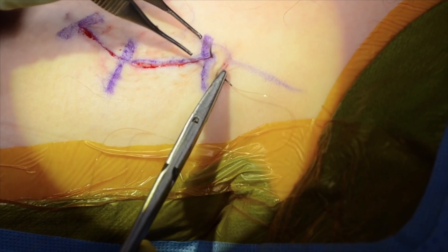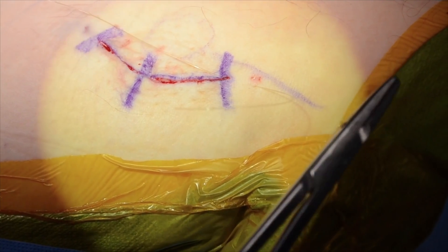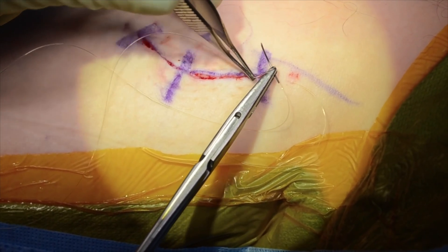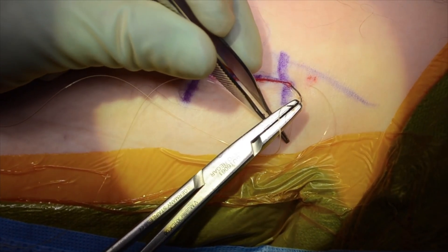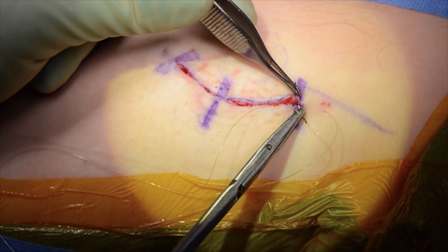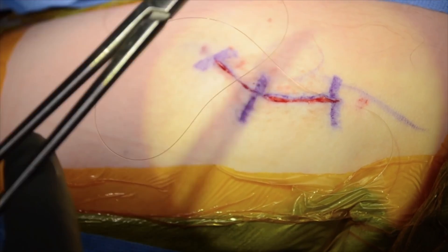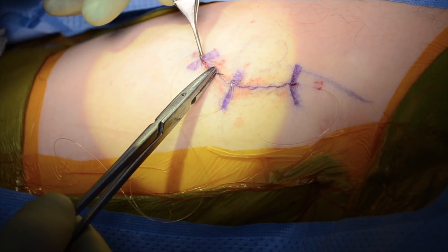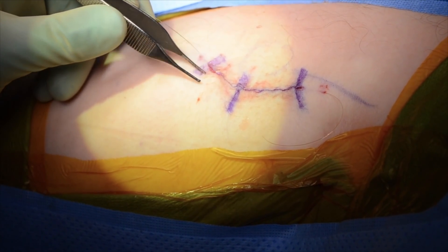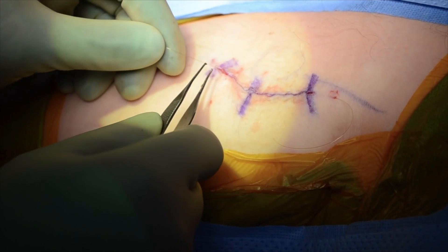The skin is then closed with a subcuticular 3-O monocryl stitch. This stitch is initiated by coming through the skin to the apex of the incision. Prior to the first throw, the thread is wrapped around the needle twice. Pulling the thread exiting from the skin helps to bury this first knot. To complete closure, the final stitch is thrown, bringing the needle through the apex, but prior to pulling the needle through the skin, the thread is again wrapped around the needle tip twice. Ads and pickups can be used to feed the knot down prior to burying the knot.